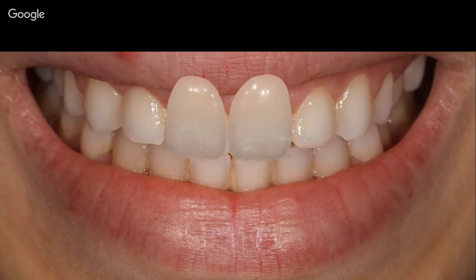Now, right here you find a very big issue which happens in most people who utilize this protocol, especially in PowerPoint. The problem is usually the necks of the teeth, which are impinging on the upper lip. So if you have a gummy smile, no problem. The necks of the teeth will simulate a gingivectomy. But if you have a patient who has a regular smile, the lip is not stretched out so much, you have the neck of the teeth impinging on the upper lip, which seems really weird. So when the patient sees this picture, he's going to feel that, okay, something is not right here.